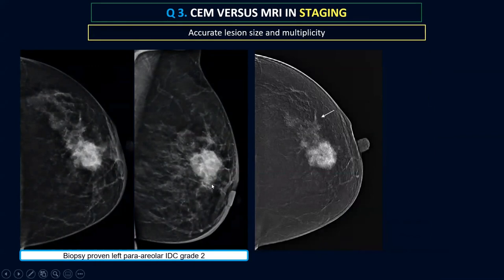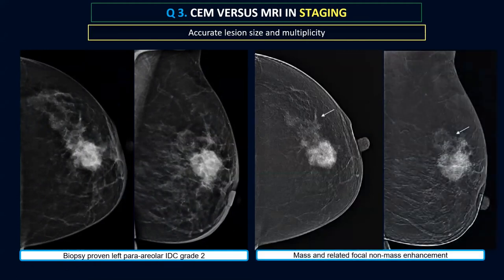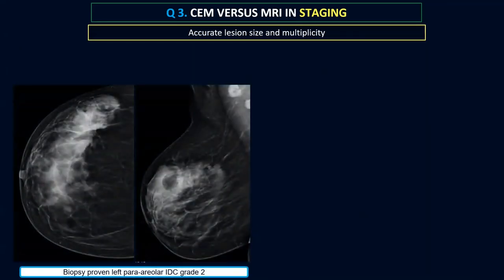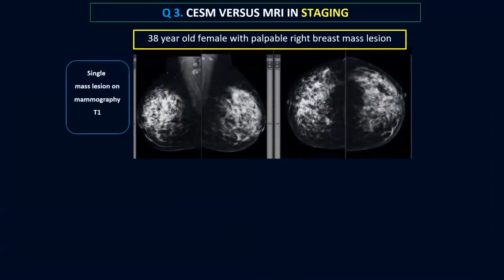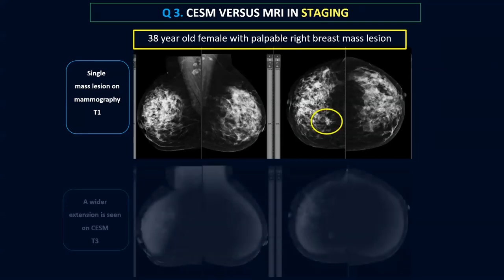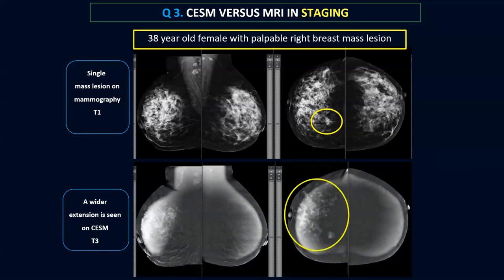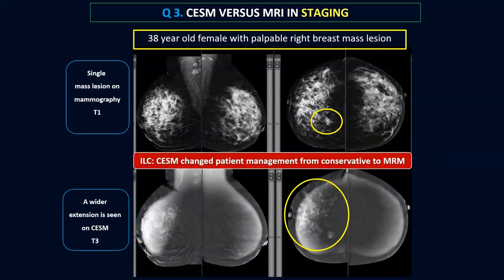Another case with a biopsy-proven right paraareolar invasive duct carcinoma grade 2: on the mammogram it was difficult to identify where the true lesion was. The true lesion was in the upper outer quadrant of the right breast, and it was actually a multifocal malignant lesion. A 38-year-old female with a palpable upper right breast mass lesion was said to be a good candidate for conservative surgery. Looking at the contrast mammogram, a much wider extension of the lesion was seen, and the management changed from conservative surgery to modified radical mastectomy.